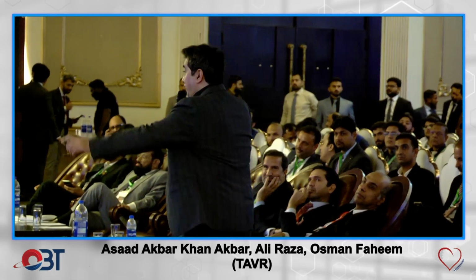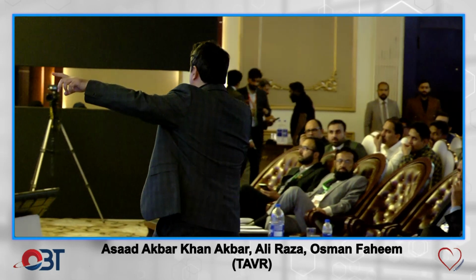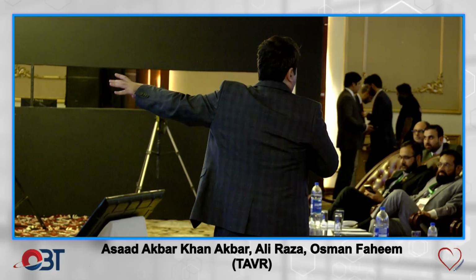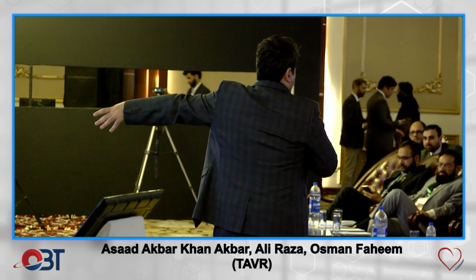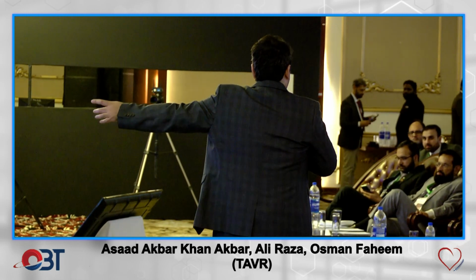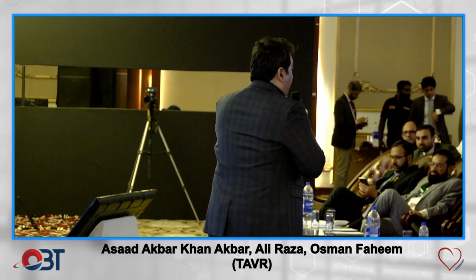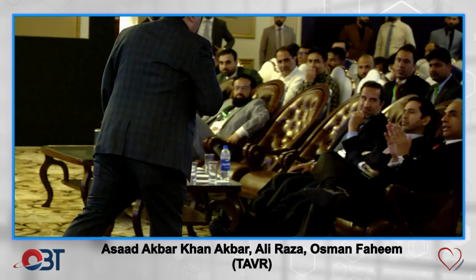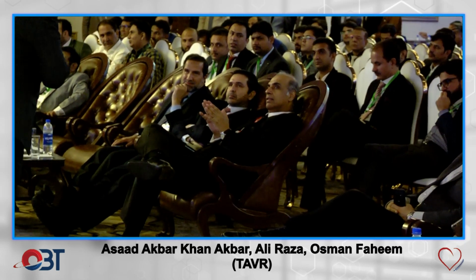Sir, that's a very good point. There is some paravalvular leak there, but believe me, this will disappear in 10 minutes, I think. And in a month's time or so, it will have reshaped altogether and it will be completely gone. So mild paravalvular leak, leave it. This is to be handled, okay.